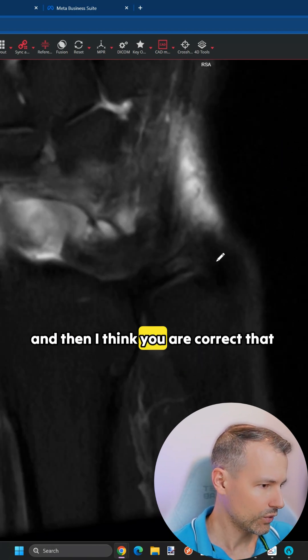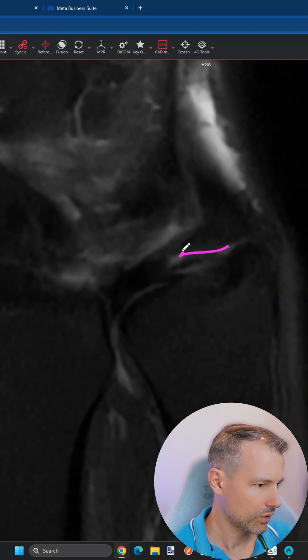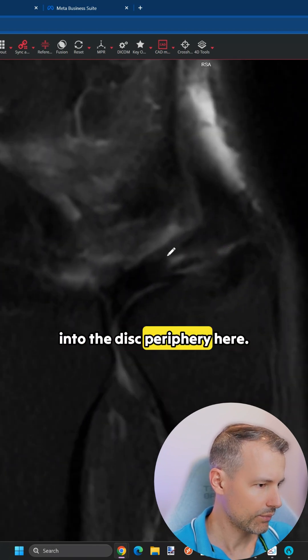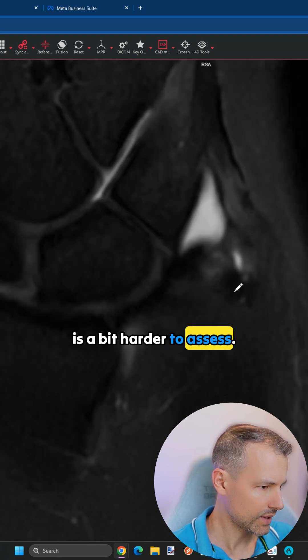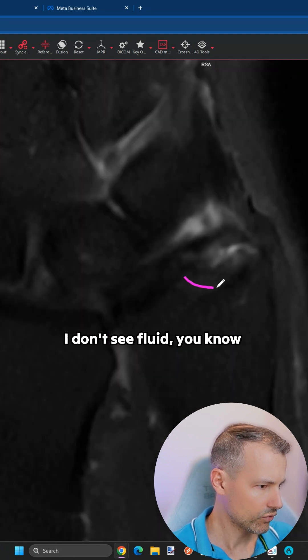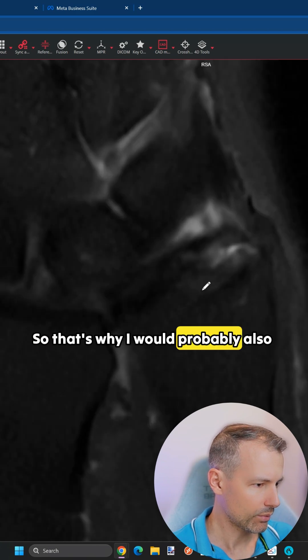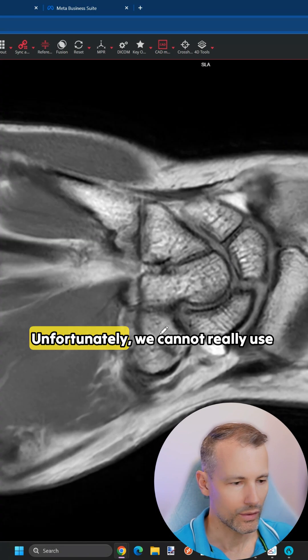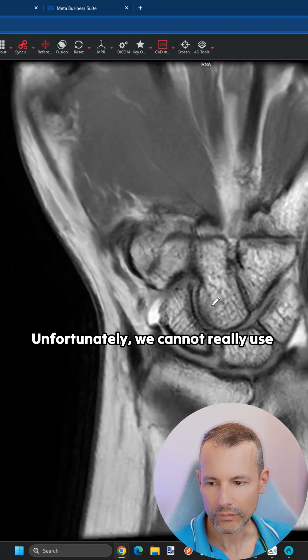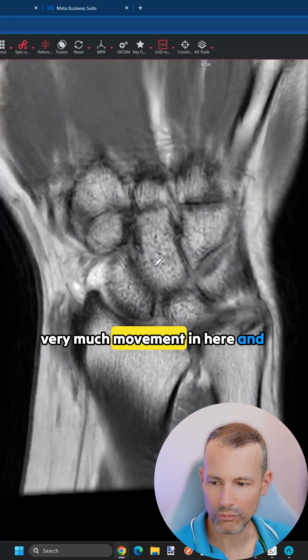I think you are correct that there is some interstitial tear component into the disc periphery here. The foveal attachment is a bit hard to assess — I don't see fluid transecting it somewhere here. So that's why I would probably also conclude, as you said, that it's intact. Unfortunately we cannot really use this T1 here because there was very significant movement.